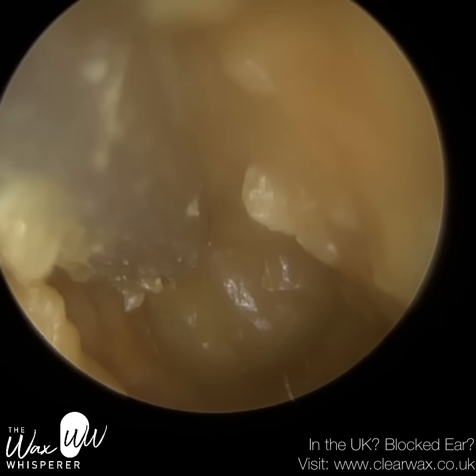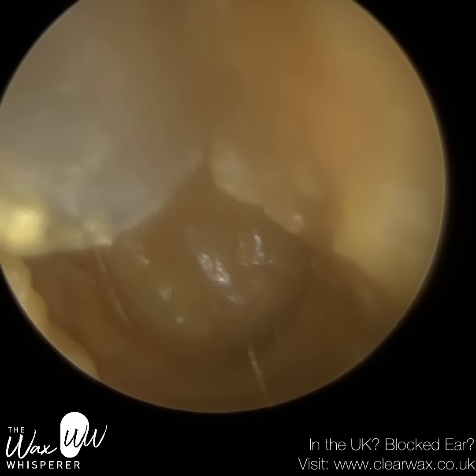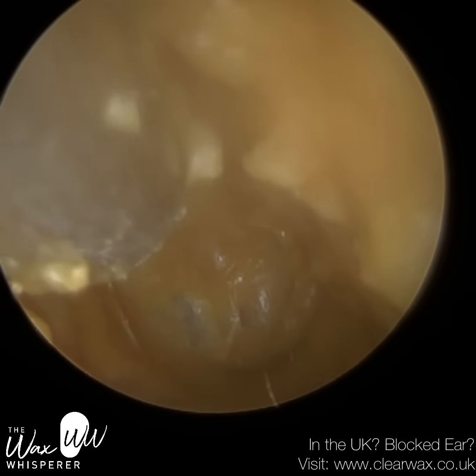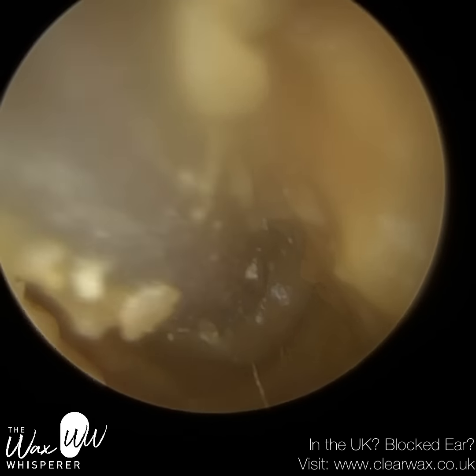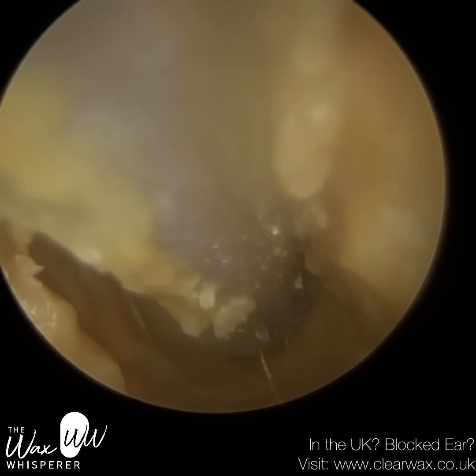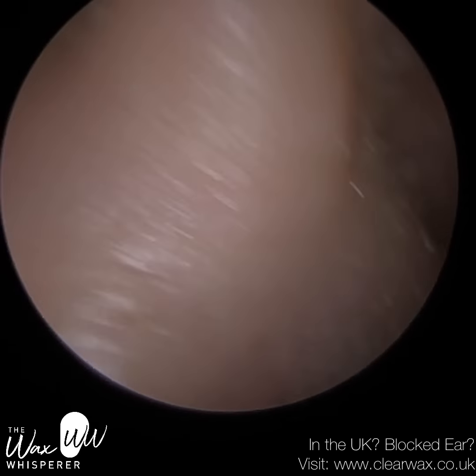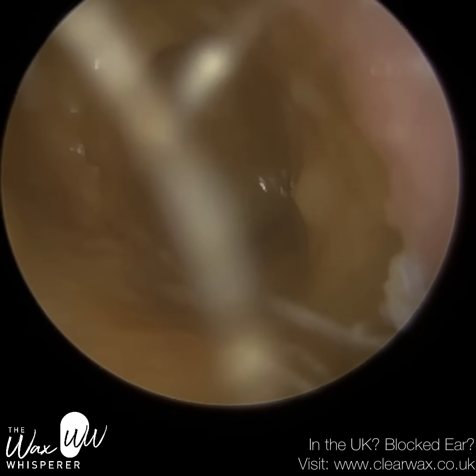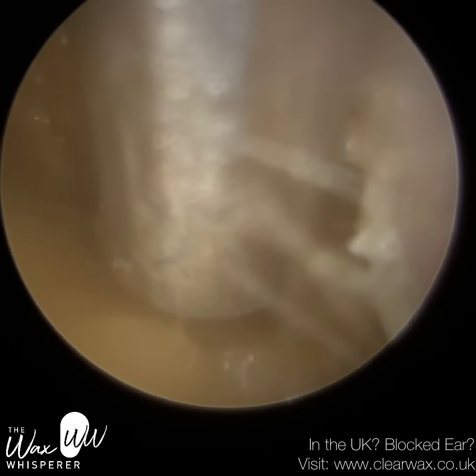So as you can see, we're tunneling through, but I don't know at the moment where the patient's eardrum is, because I don't know the viscosity and how thick this layer of discharge is. Now I can just see some of the eardrum, and that's giving me a benchmark. On the left-hand side, you can see a bit of a blue tinge appearing through this discharge. So now I am feeling a bit more comfortable because I've got the depth. I know how far I need to go in. I don't want to over-insert the suction probe, whereas previously I just wasn't sure where that eardrum was. Now we can make an educated guess.